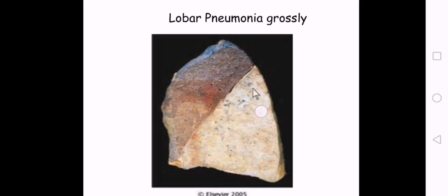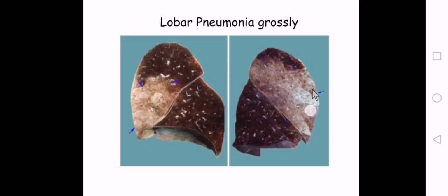If you can compare it with this gross picture of a lung, تشوفون هاي whitish to yellowish consolidated lobe, as you can compare it with the normal remaining lung, slightly edematous. كل هاي signs of inflammation. Again, this is the abnormal area, shows white or yellowish consolidation as compared to the normal remaining lung, slightly edematous. والإديمة هاي معروفة من واحدة من changes اللي تصير بالacute inflammation.